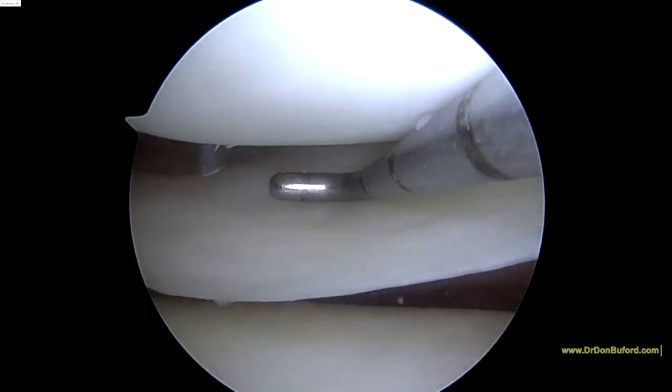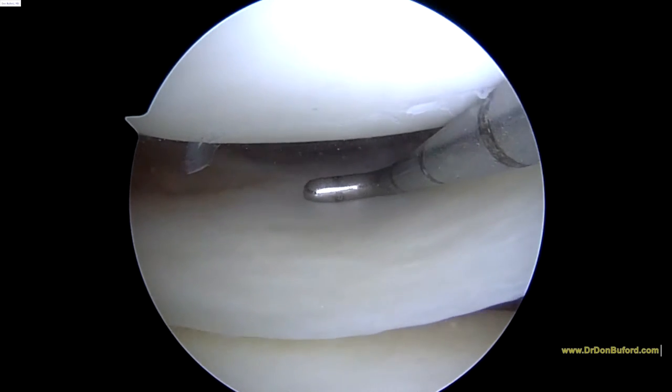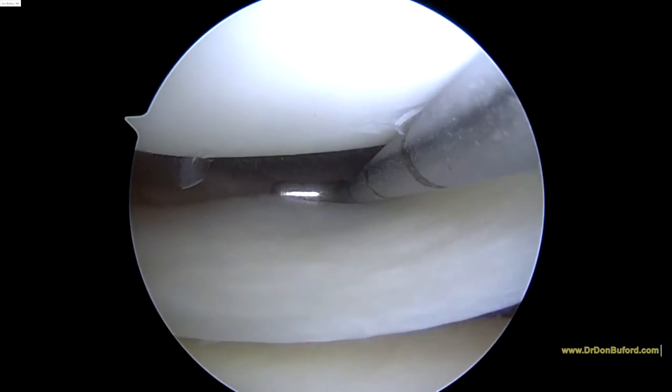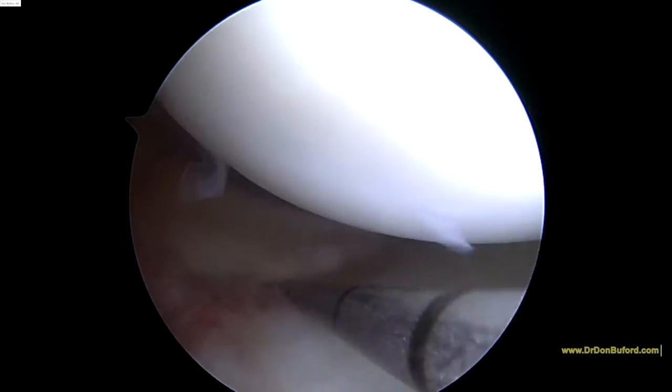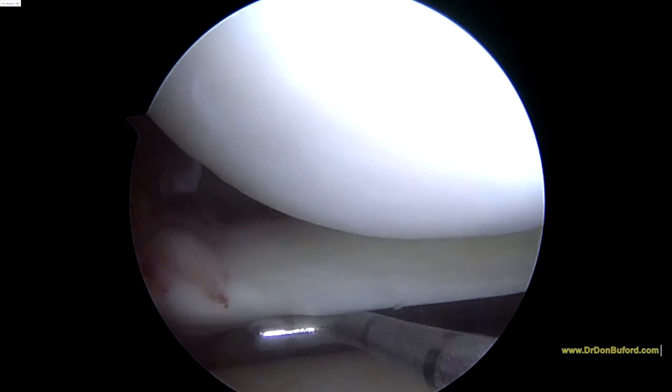So we're further defining the tear, and what we see here is this is okay, or it becomes not okay, right where this probe tip drops into the tear. And you can see how that's the posterior horn of the medial meniscus.